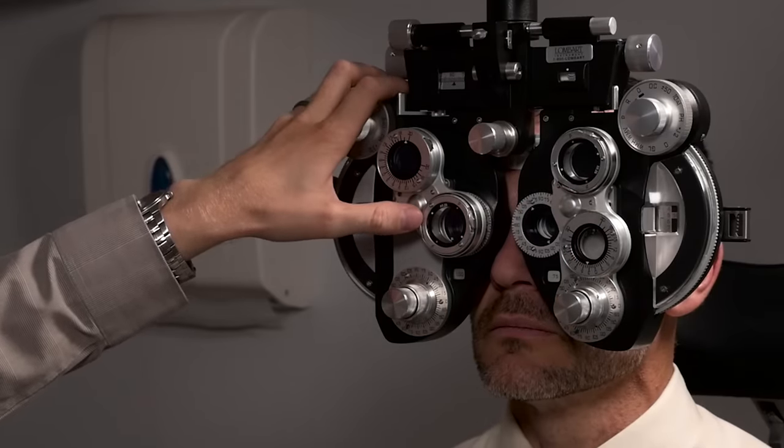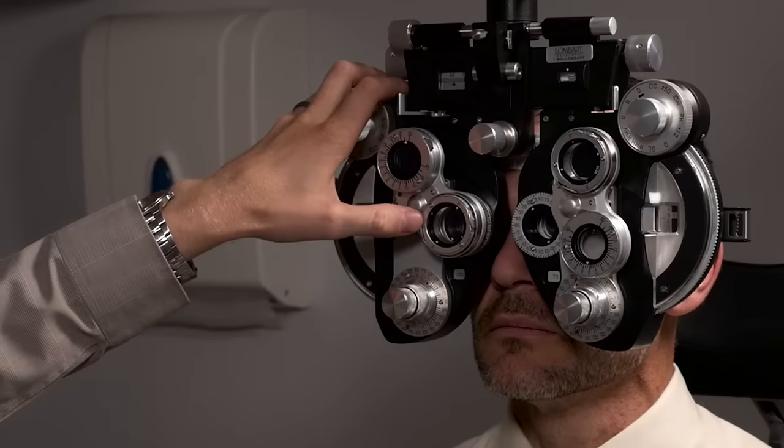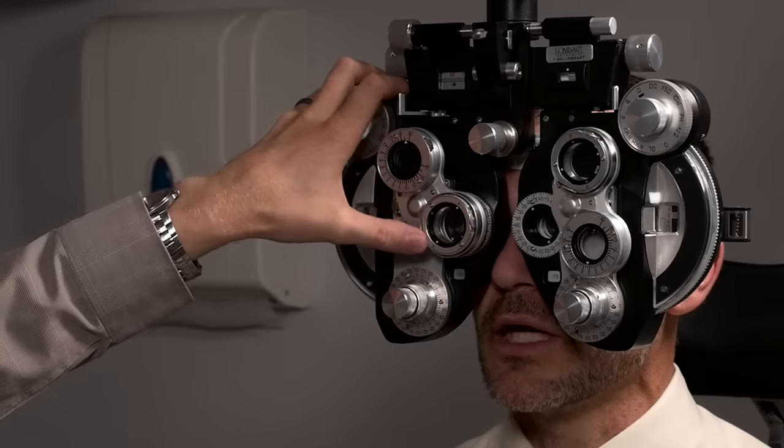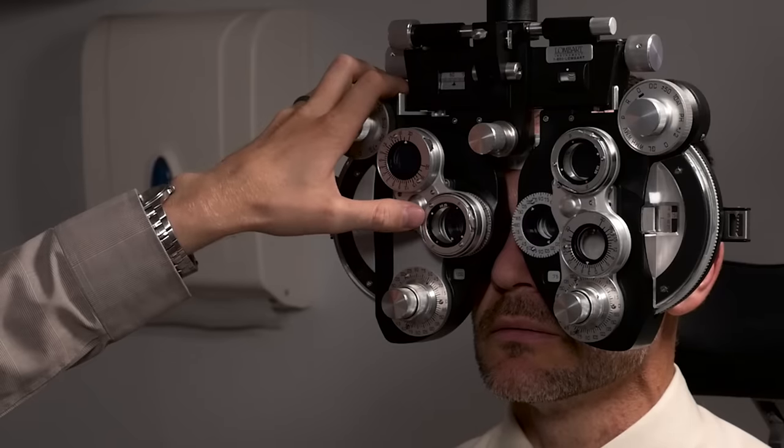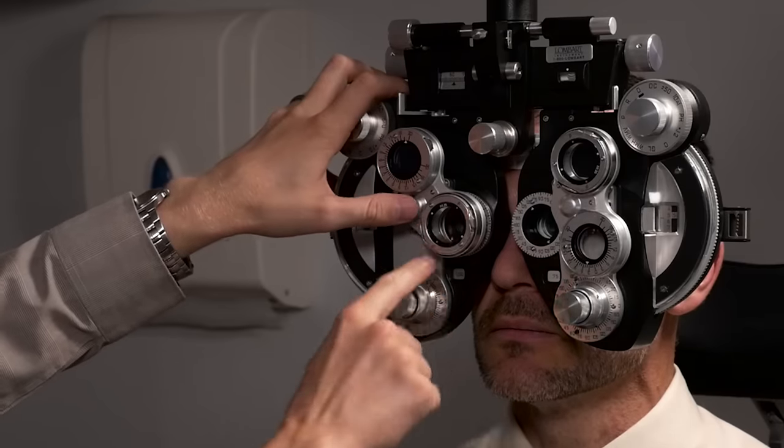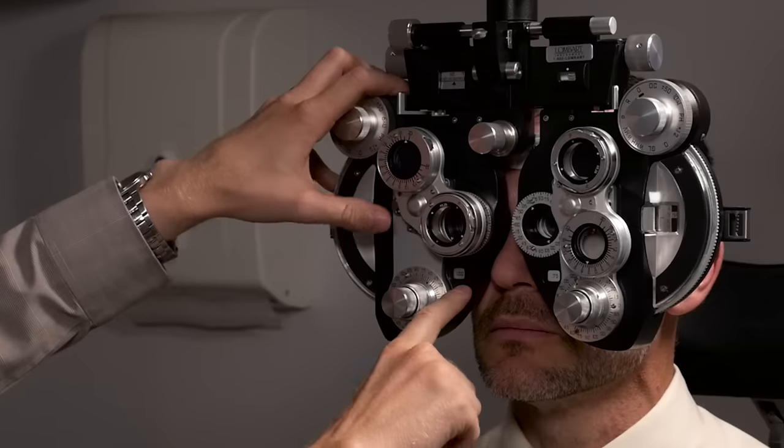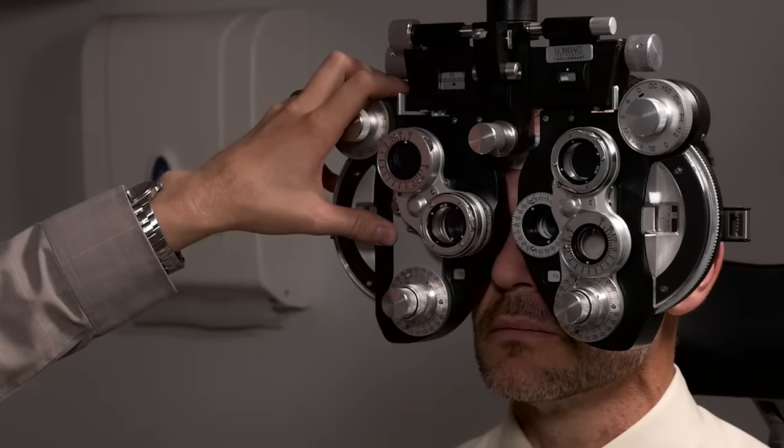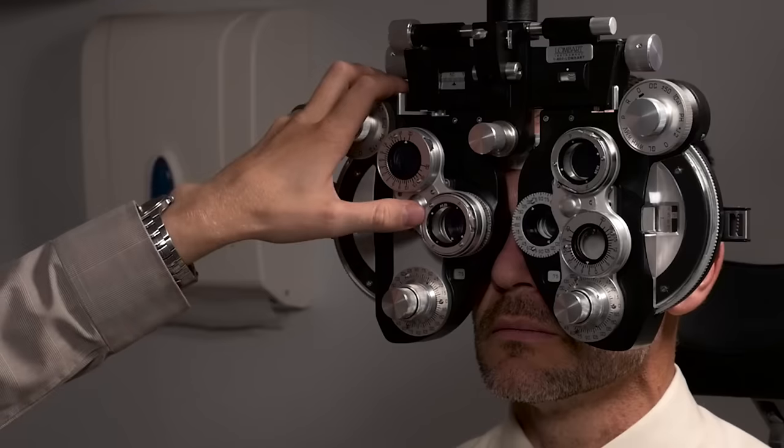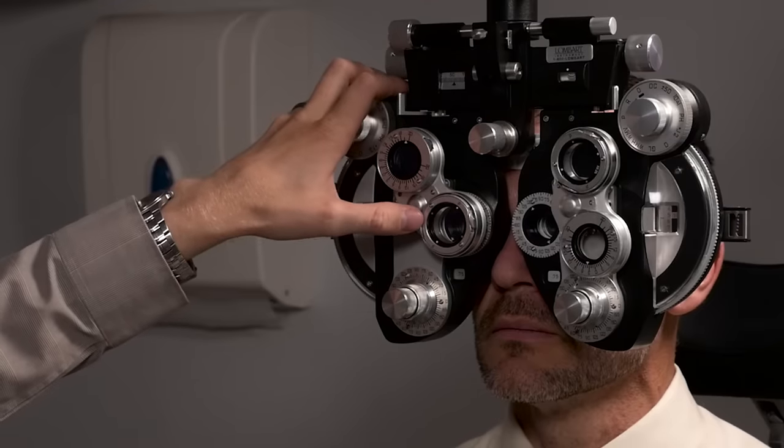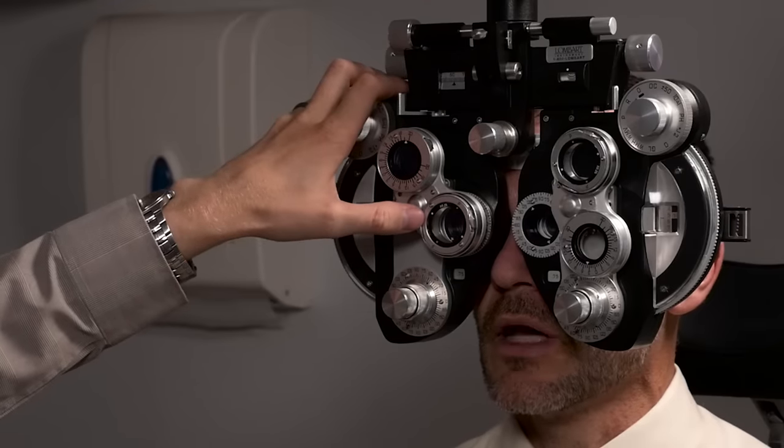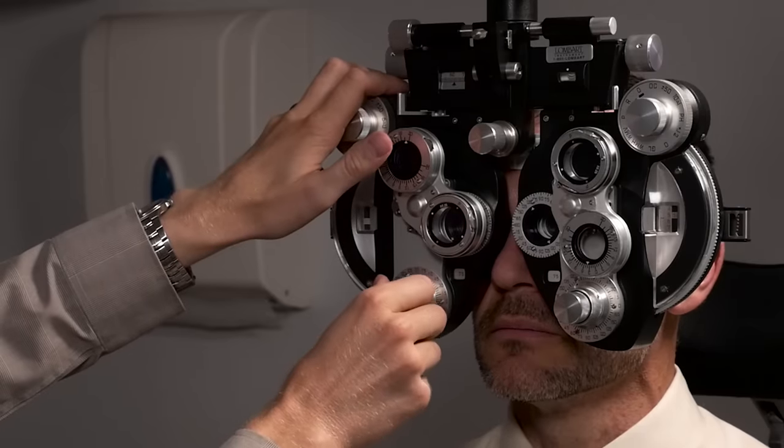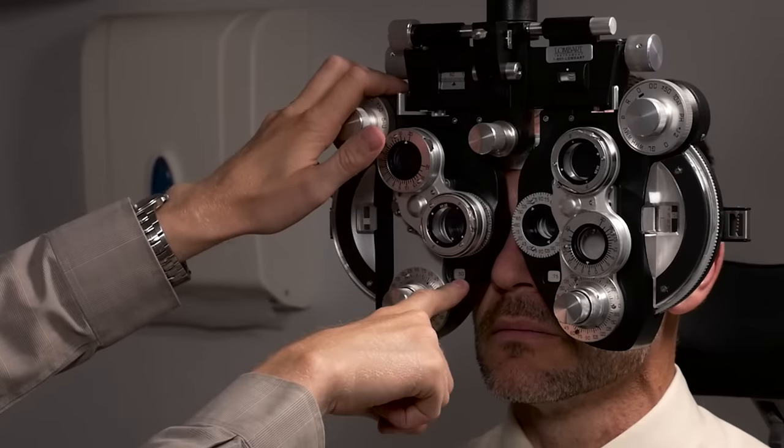So in this case let's ask him what's more sharp and clear? Number one or number two? Two. So he liked it better with the red and currently he has one diopter of cylinder in there so I'm going to take out a quarter. And then I'm going to ask him again what's more clear? Number one or number two? About the same. Pretty close. And I want to be a little more sure so I'm going to take it down to 0.5 cylinder.